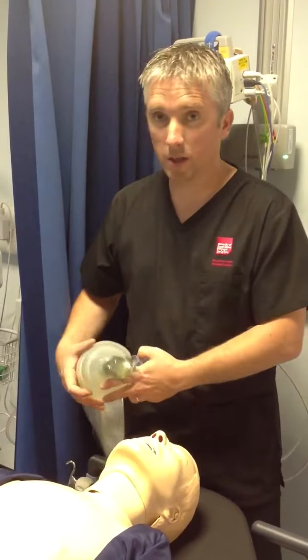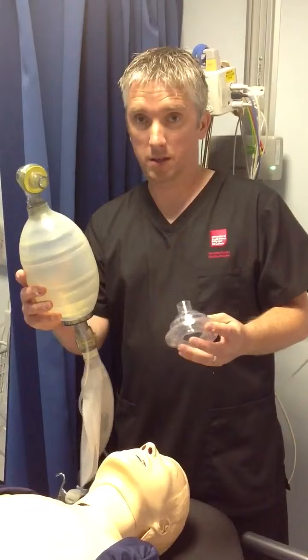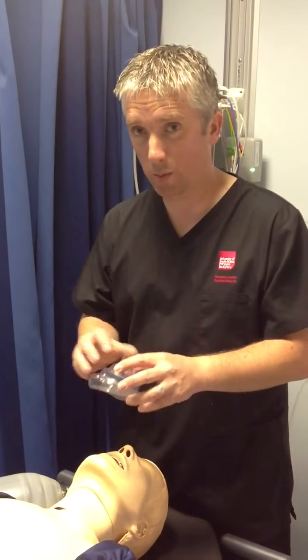Once you've established that your patient needs the airway maintained, the two pieces of equipment you need are a self-inflating bag or an Ambu bag and a mask. It's very important to correctly fit this mask for the patient.